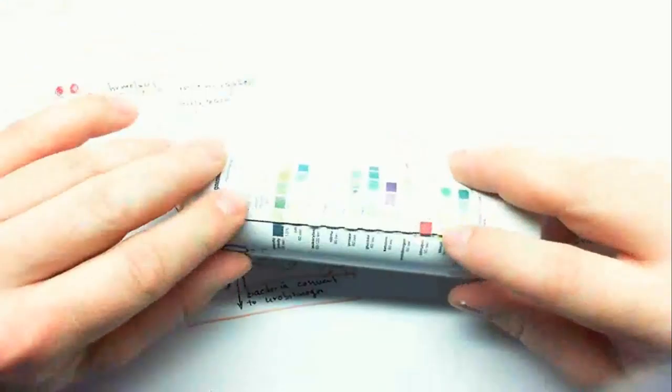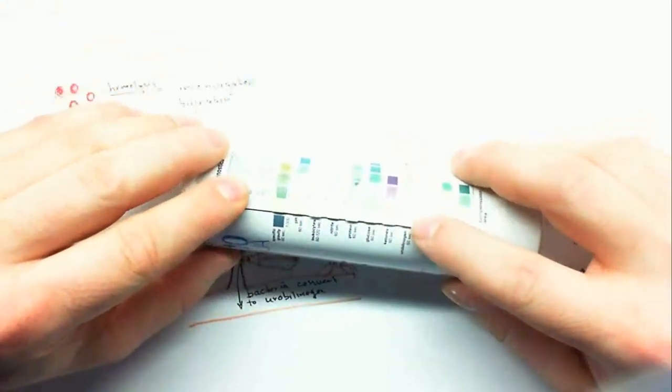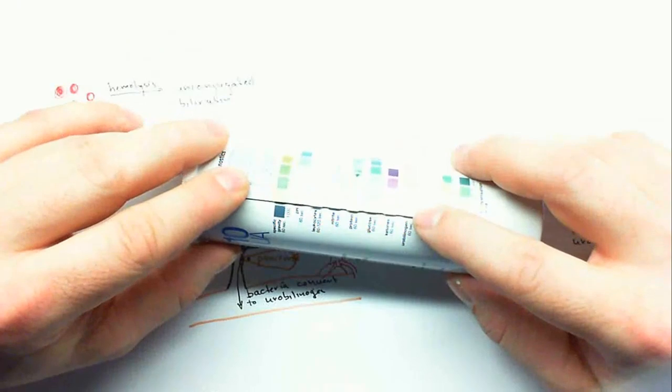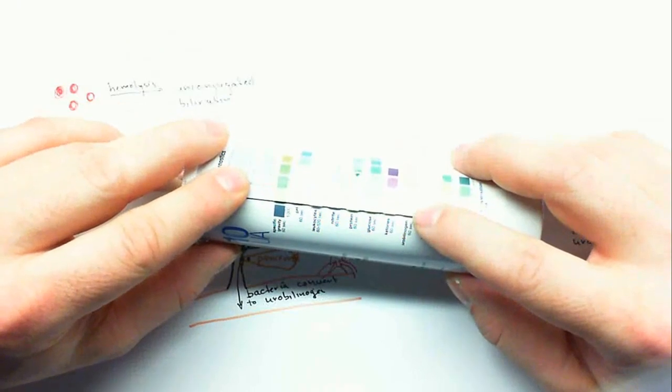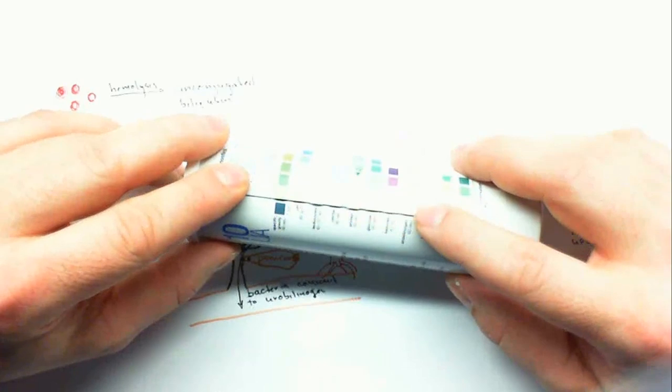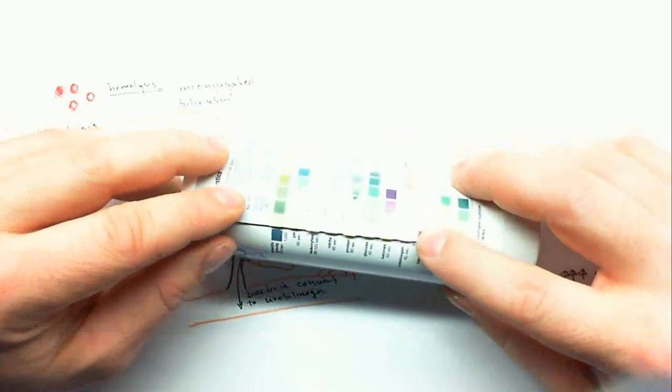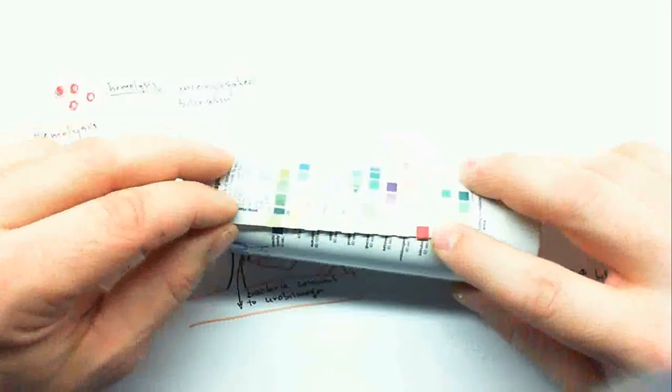In this stick, there's high bilirubin and low urobilinogen. There should be urobilinogen on the stick, and its absence suggests an inability to get conjugated bilirubin into the gut. In fact, the increase in bilirubin confirms this, and so this is a test that's positive for biliary obstruction.